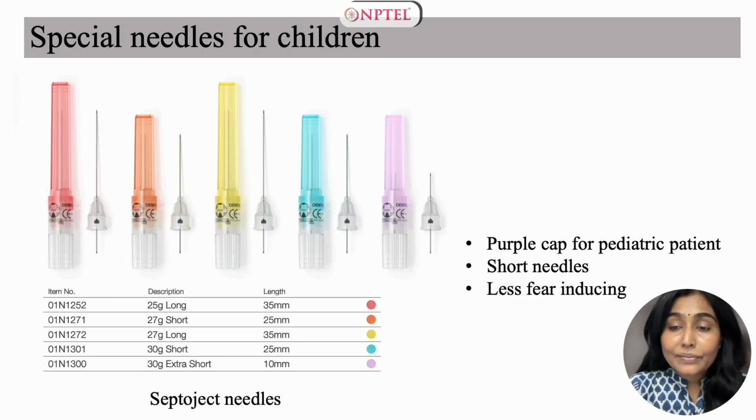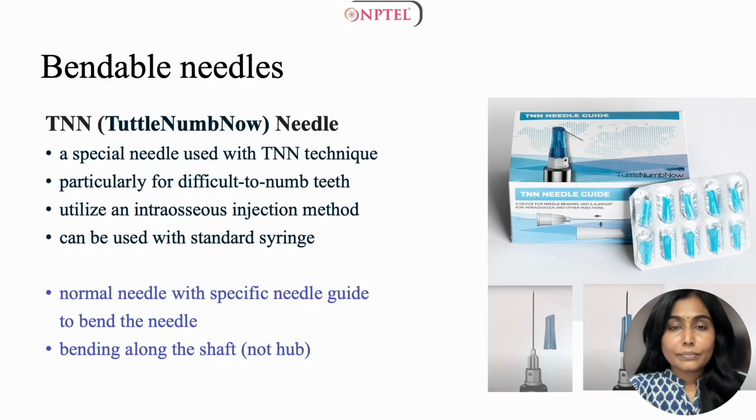We also have special needles for children, which are indicated by specific colors. Purple cap for pediatric patient. These needles are typically short because short needles induce less fear in patients.